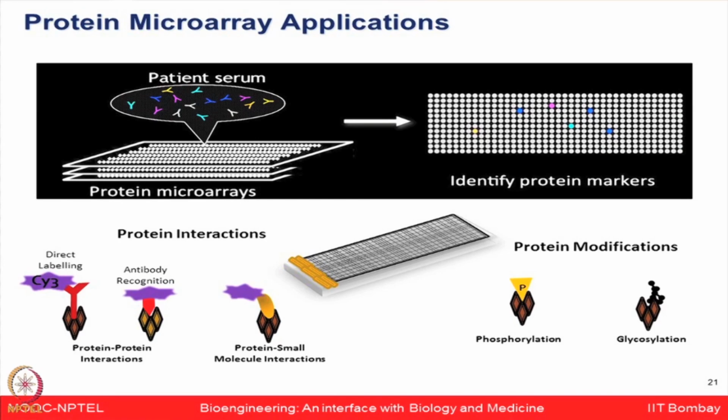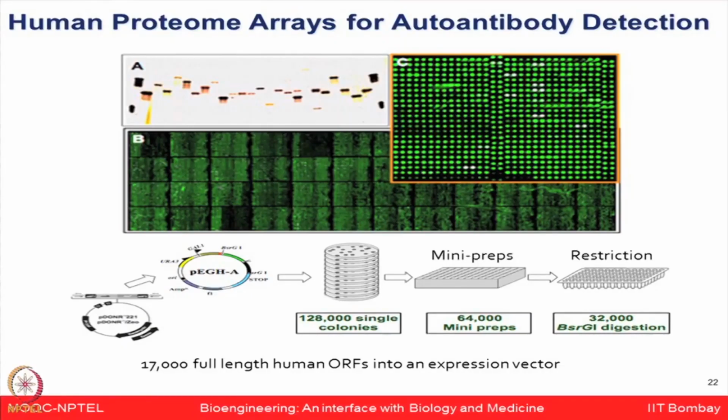All of these have been studied using protein microarrays. One of the other strong applications of this is looking for autoantibodies. Many times, for different autoimmune disorders and cancer, the body will start producing some antibodies to try to combat and fight the disease, and those could be detected on the protein arrays.